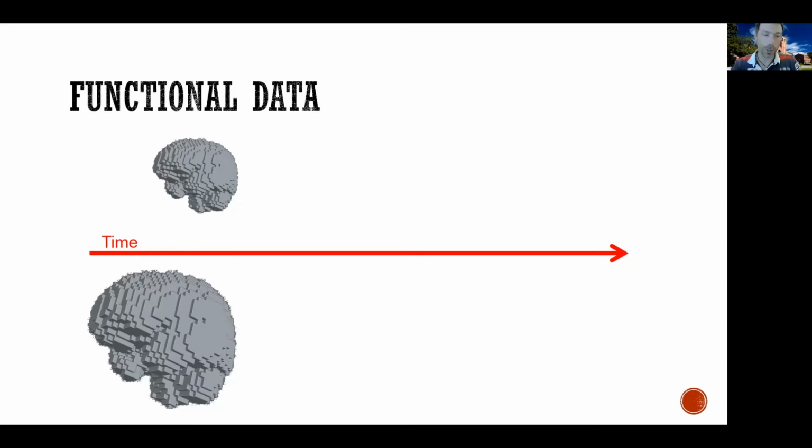Now, one intuition is more spatial in nature and views MRI data and fMRI data as a more spatial thing. So typically, when we acquire one data set, what we're doing is we're acquiring a series of images of the brain, each one of which we refer to as a volume. So if I say a volume of data, I literally mean one image of the brain. And as you know well, each image of the brain is made of voxels, small cubes.